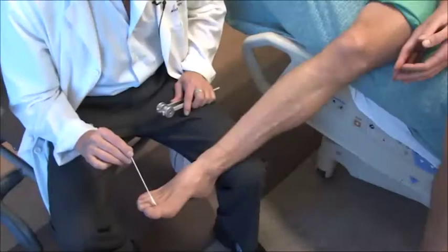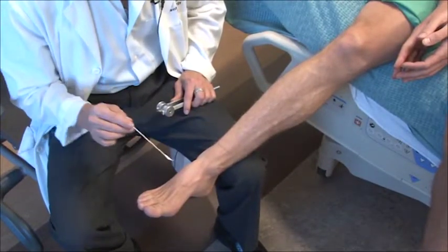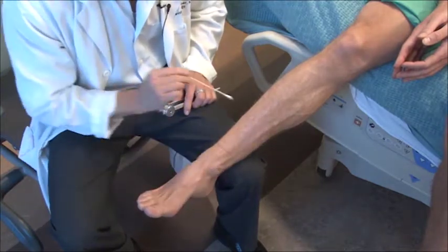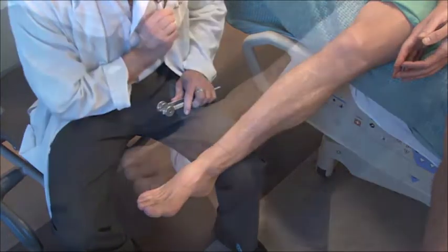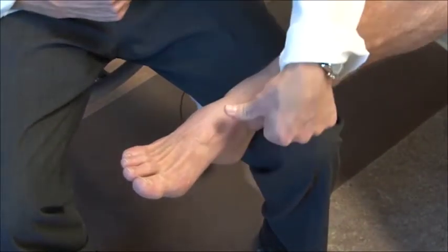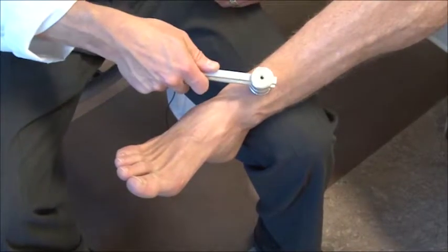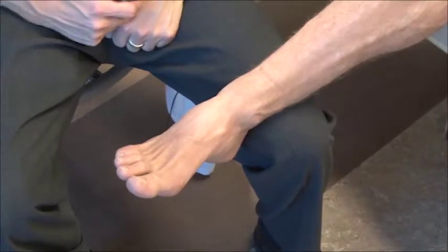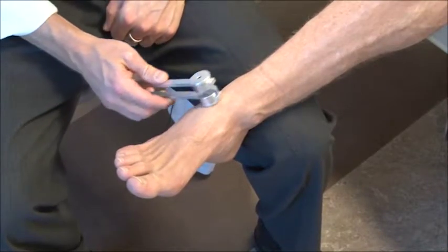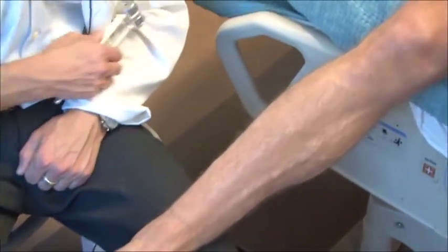Sensory testing should be tailored to the complaints of a patient. A general sensory examination should focus upon the distal aspect of the lower extremities, starting with the assessment of light touch. Hot and cold sensation can be assessed by asking the patient to identify hot versus cold when eyes are closed, using the cool metal of a tuning fork compared to the heat of a thumb. Alternatively, one can run the metal of a tuning fork from the distal foot up the proximal leg to assess for graded sensory loss of the lower extremities.